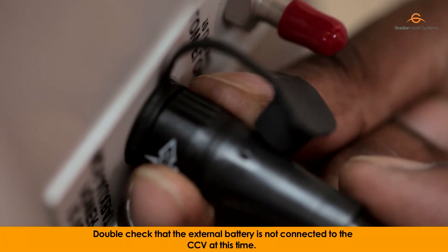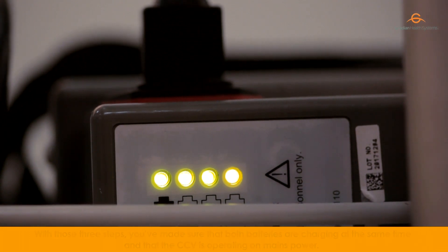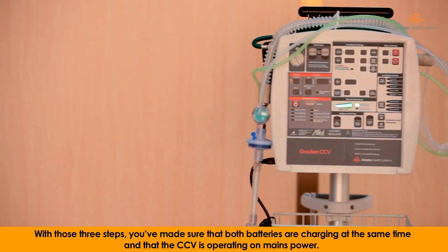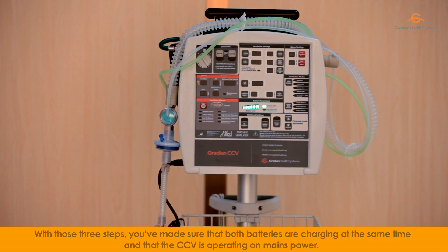Double check that the external battery is not connected to the CCV at this time. With those three steps, you've made sure that both batteries are charging at the same time and that the CCV is operating on mains power.